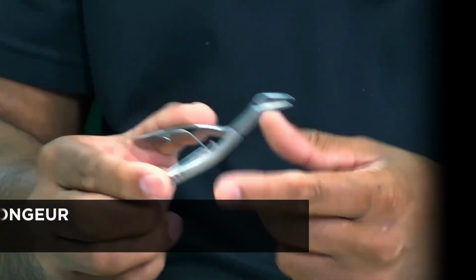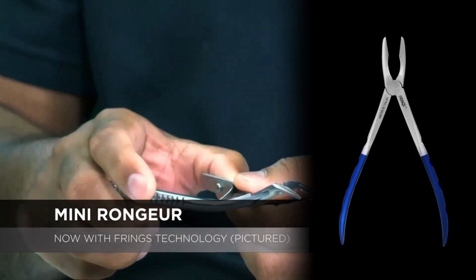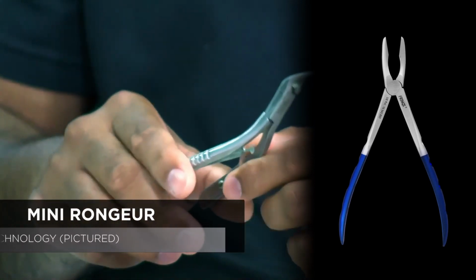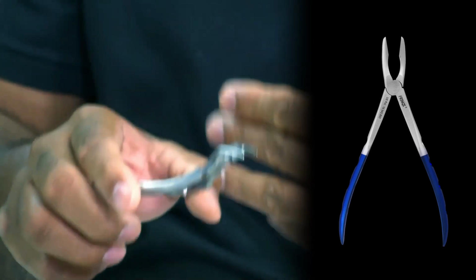Another instrument that we have here is a mini rongeur. Now this rongeur also has the springs built into it, so you don't have to manually open it up. That's really hard. I find that to be a pain when you're working in the back. And I wanted a mini rongeur because I use this a lot, sometimes to remove root tip fragments as they get loose, to be able to grab something, to have a little bit of force behind it, to be able to grab it really well.